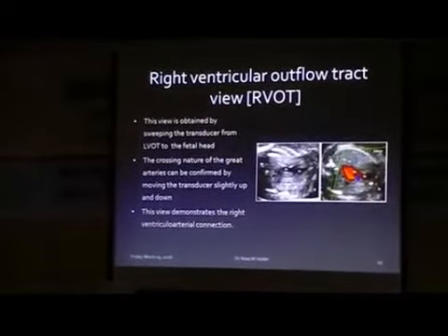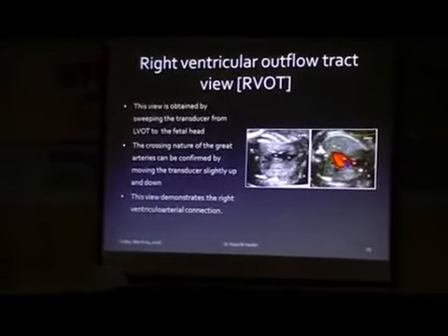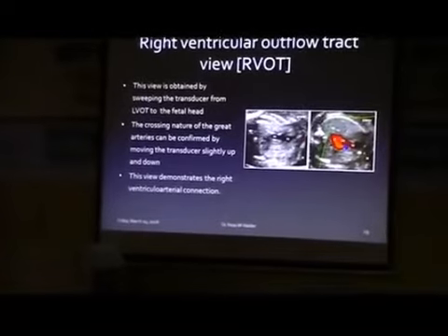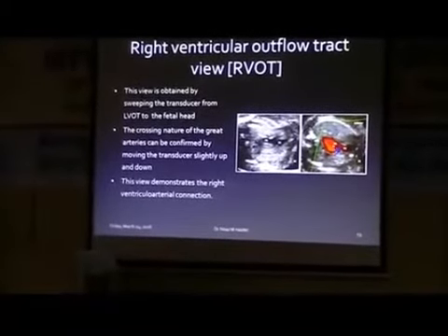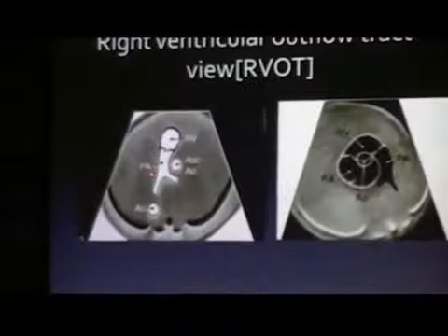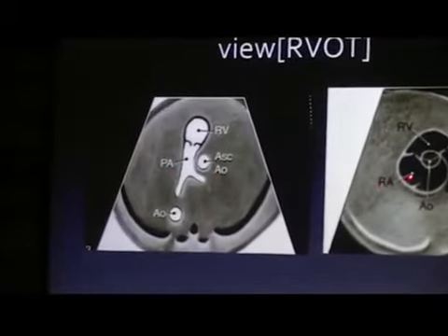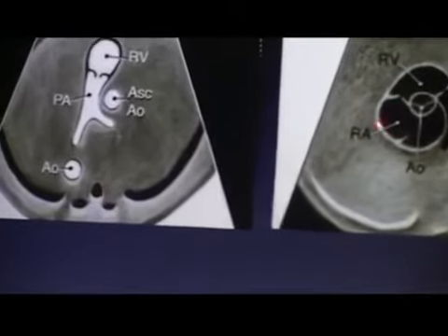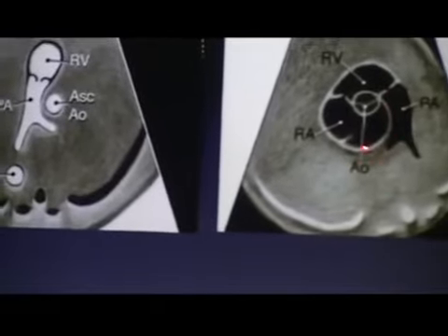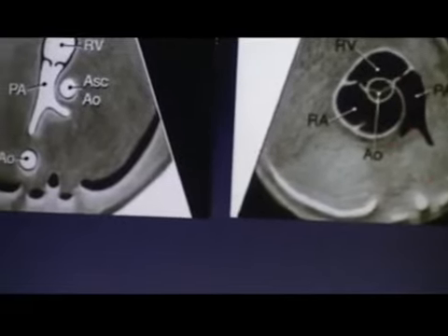This is the right ventricular outflow tract view — this is the pulmonary artery with its branches. Right ventricle and pulmonary artery with branches, and aorta in cross section. This is the right atrium, and the pulmonary artery with its branches, and the aorta at the center.